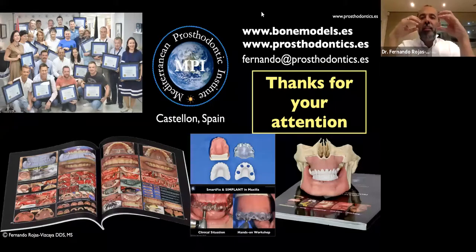Design the prosthesis to create a perfect transition between the composite or the pink prosthetic area and the soft tissue of the patient, and how the patient can clean. We never remove the prosthesis in patients with 5, 7, 8, 10 years. When I make the evaluation, if I don't see any plaque, any calculus, tissue very healthy, I don't remove it, just X-ray and everything okay.